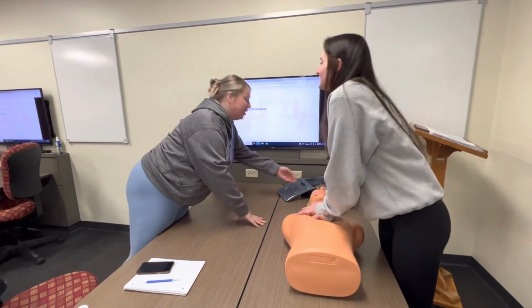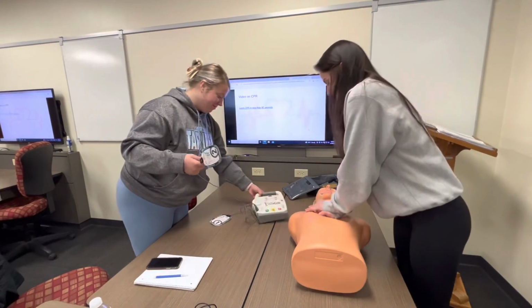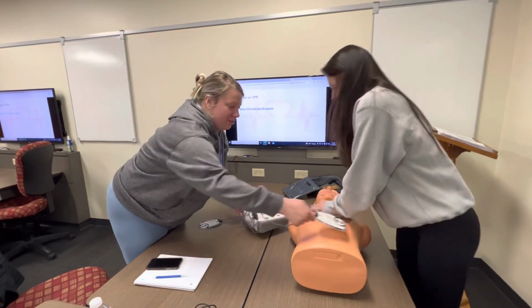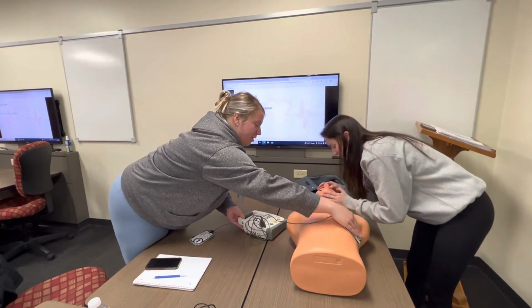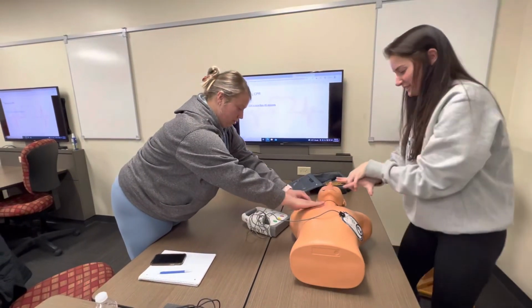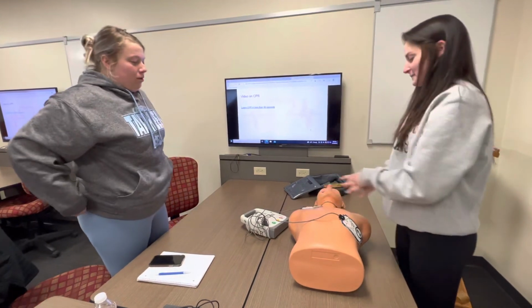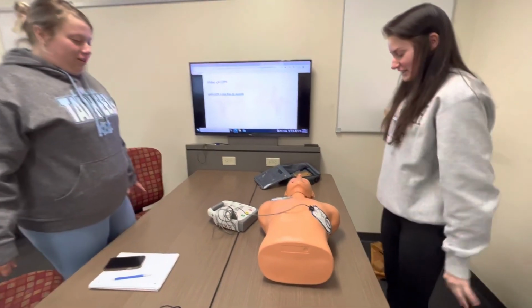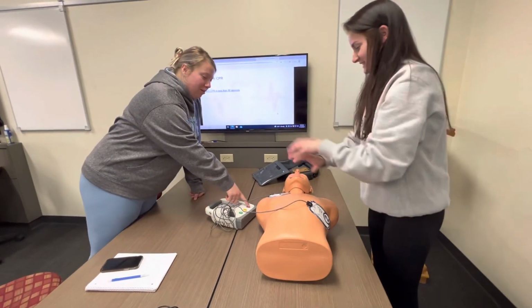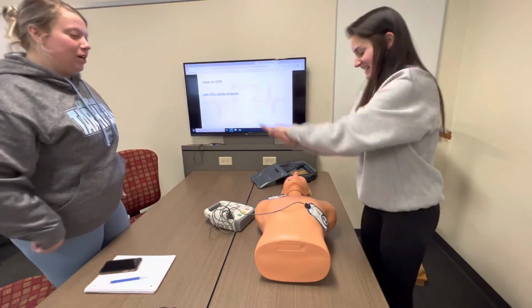Oh, look, I found an AED. Thank you. Let's get it set up for you. Still do compressions, since she's still going. Okay, I turned it on. It says stop. Yep, so stay clear. Make sure they know. And then it says shock advised. You can continue compressions after the shock. Shock advised. Okay. Beep. Shocked them.